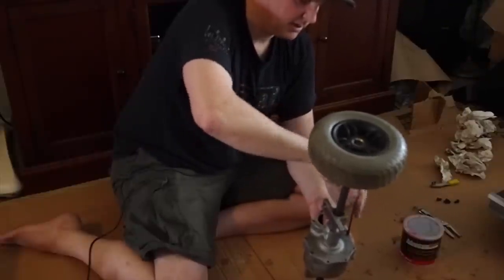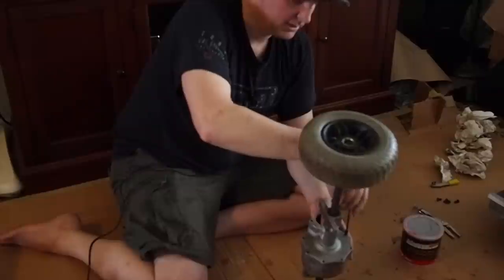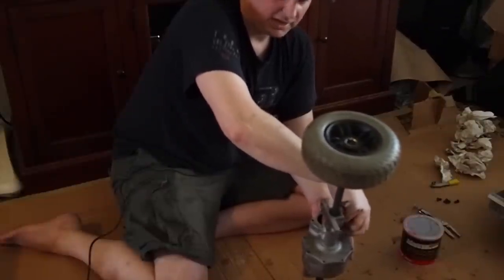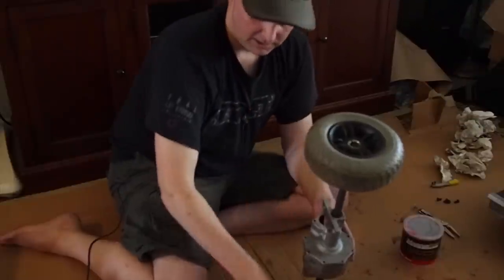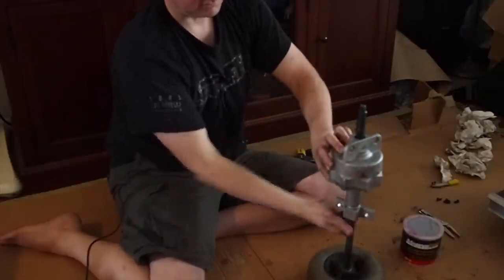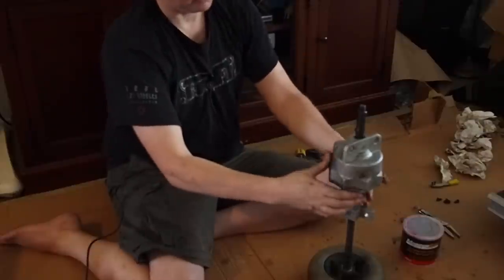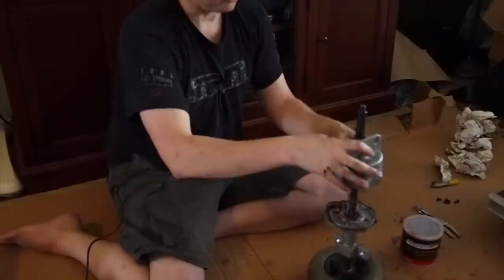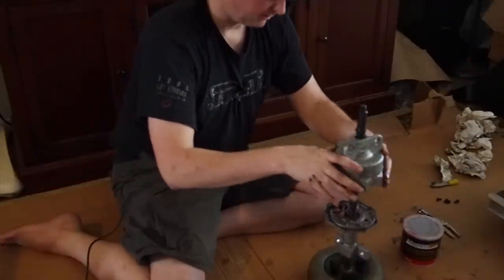So let's take this apart. Almost finished. I tried to take this wheel off, as you saw, and I left it on, and actually it's a pretty good stand. I could just leave it like this and take this whole thing apart with the wheel like that, and I have a nice good stand. So actually, leave the wheel on, don't take it apart.